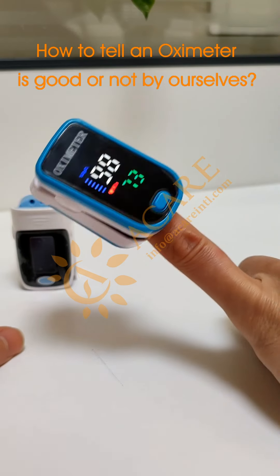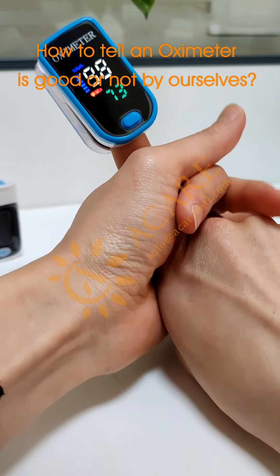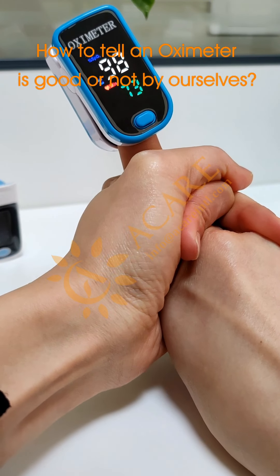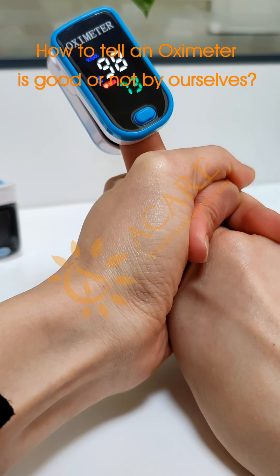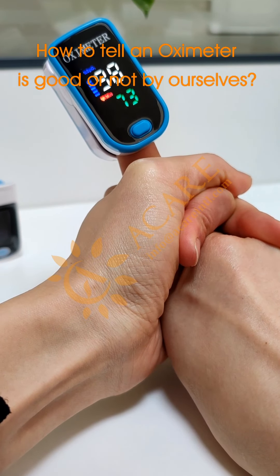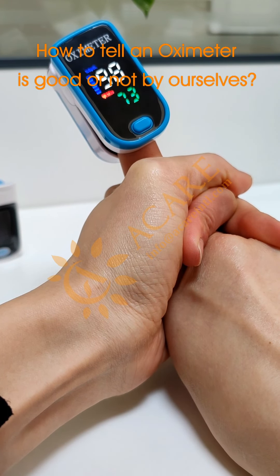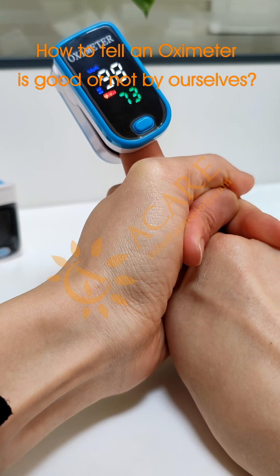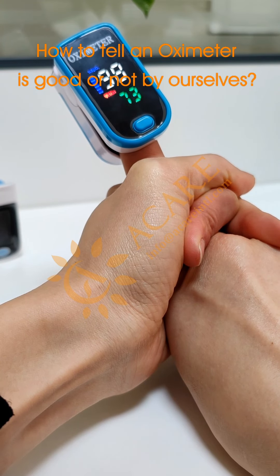Just a few seconds. The reading is out. Now I will use my other hand to hold my test finger hard. Let's see what will happen. After around 10 seconds, there are no changes.